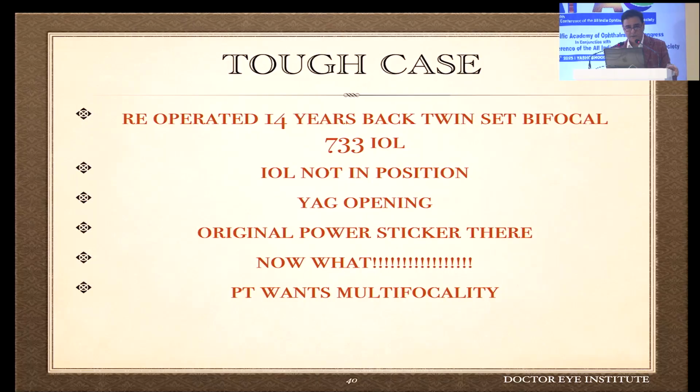Coming to IOL mishaps, this is one of the toughest cases, where it's 14 years back. I had only operated this patient.